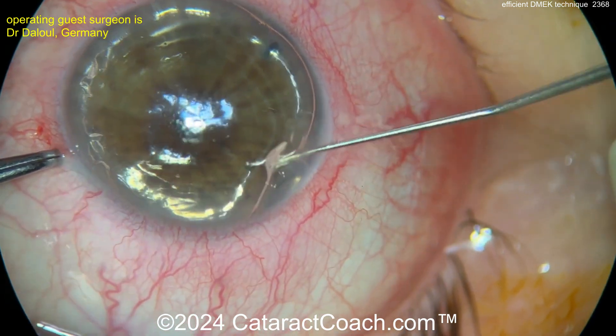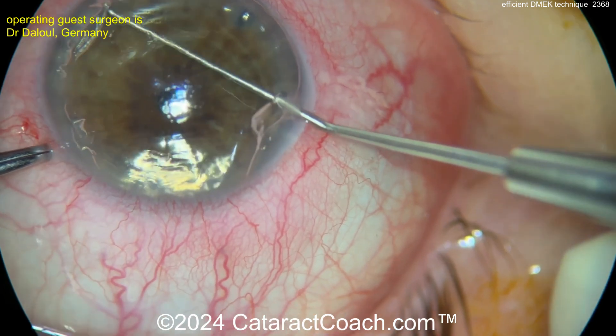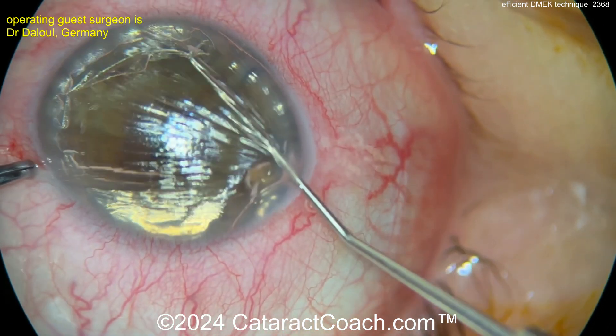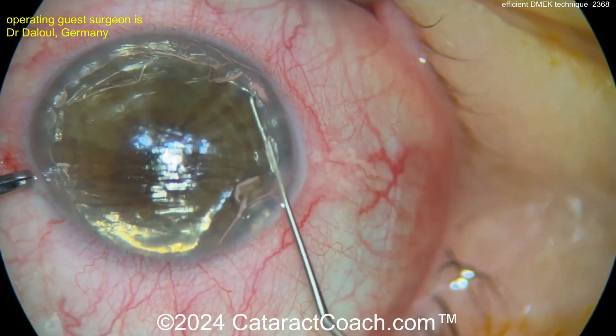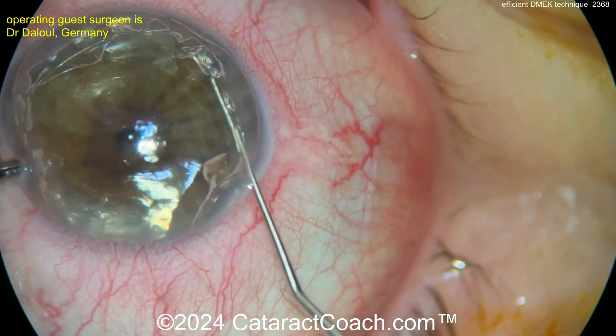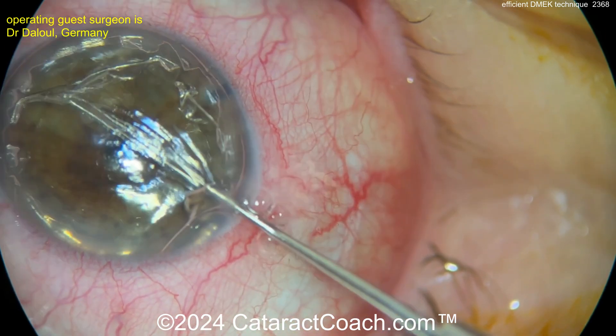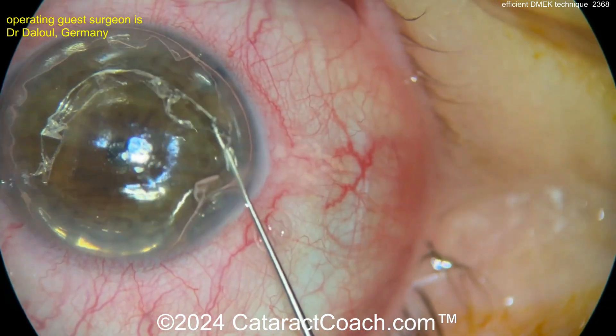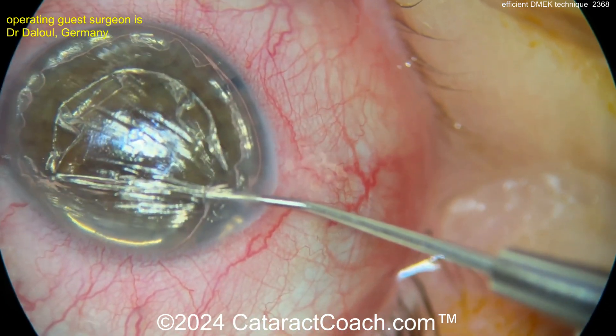It's much easier to do this with the air bubble if you haven't done this before, because it aids in visualization. We even have videos here on CataractCoach of OCT-guided intraoperative OCT, and we can guide ourselves during a DMEK procedure. Surgeons are doing a great job just getting that existing tissue off — you want to get it off in just one big piece. It's a lot easier, so take your time.